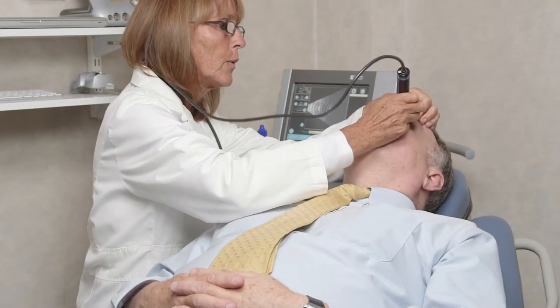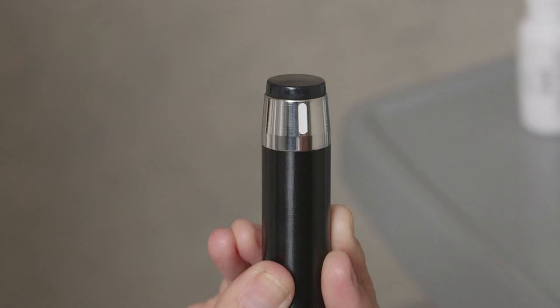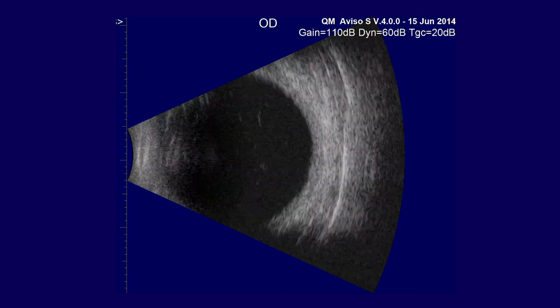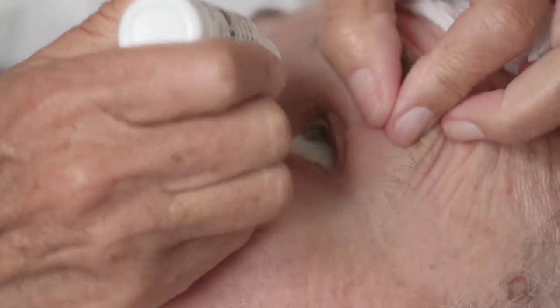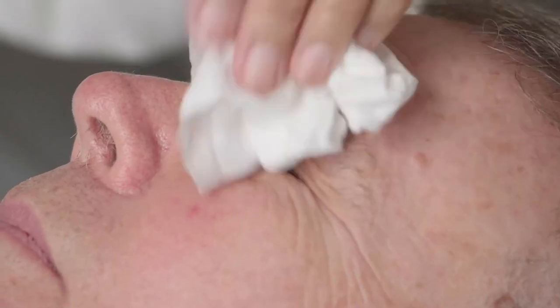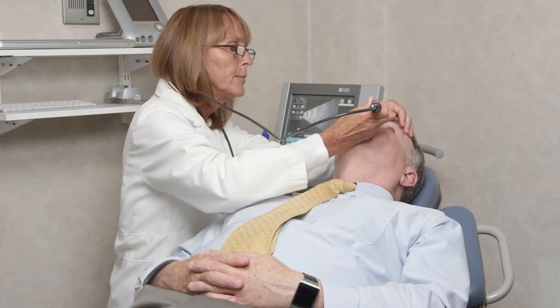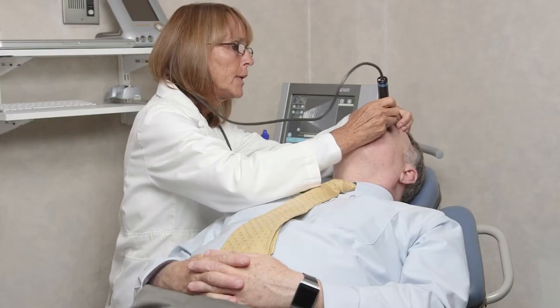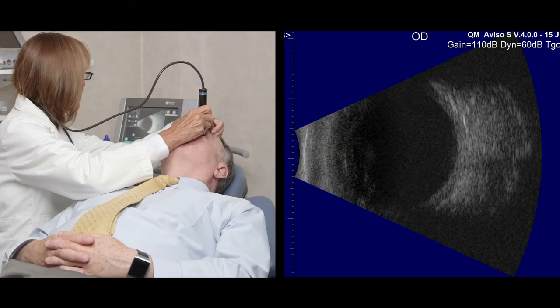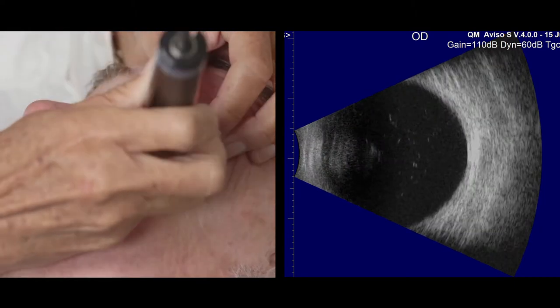It is important to pay close attention to the orientation of the probe since that dictates the orientation on the screen. This white mark on the side of the probe corresponds to the upper portion of the B-scan echogram appearing on the monitor. Note that the center of the sound beam gives the most detailed images. An anesthetic drop is applied to the ocular surface. Sometimes it is useful to anesthetize both eyes in case the examiner wishes to compare one to the other. Ophthalmic gel is used as a coupling agent to create an air-free interface between the eye and the probe. The procedure is generally performed on the open eye, with the probe placed directly on the globe. If enough gel is used, it should not be necessary to put too much pressure on the globe.